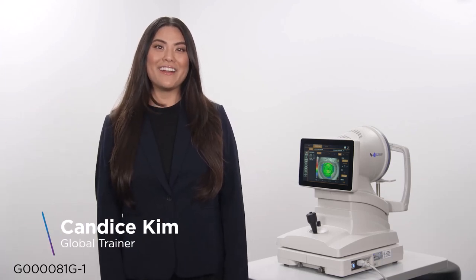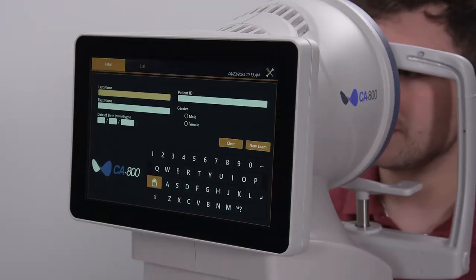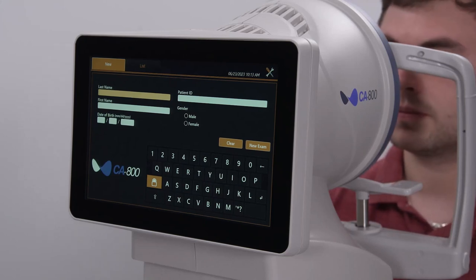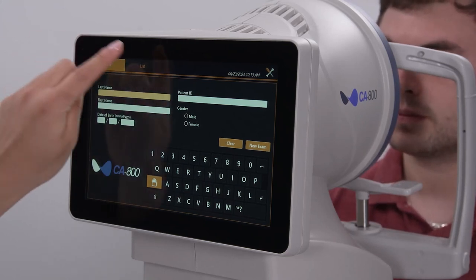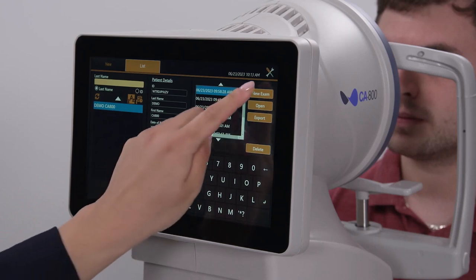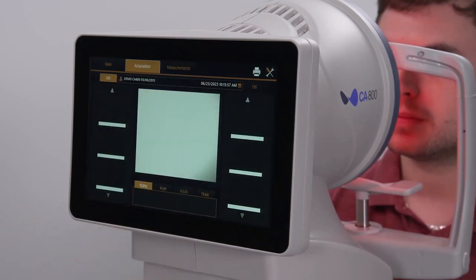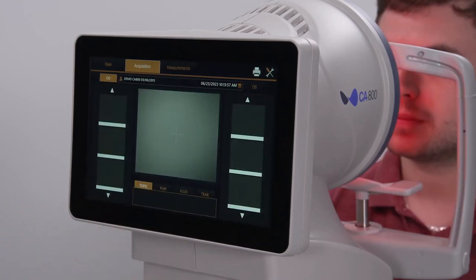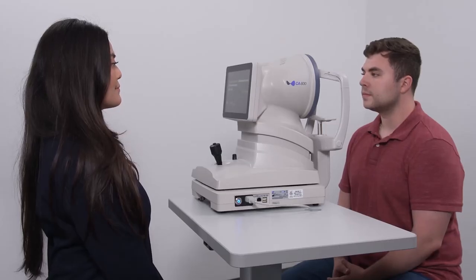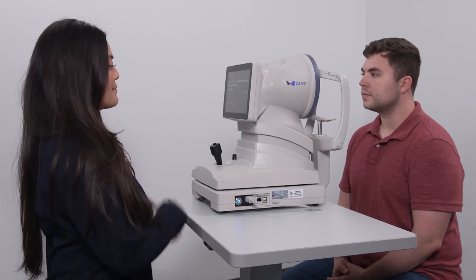Hi, I'm Candice, global trainer for TopCon Healthcare. After entering a new patient or selecting an existing patient and activating the scan acquisition, start with the CA800 pulled back towards the operator as far as the instrument will allow.